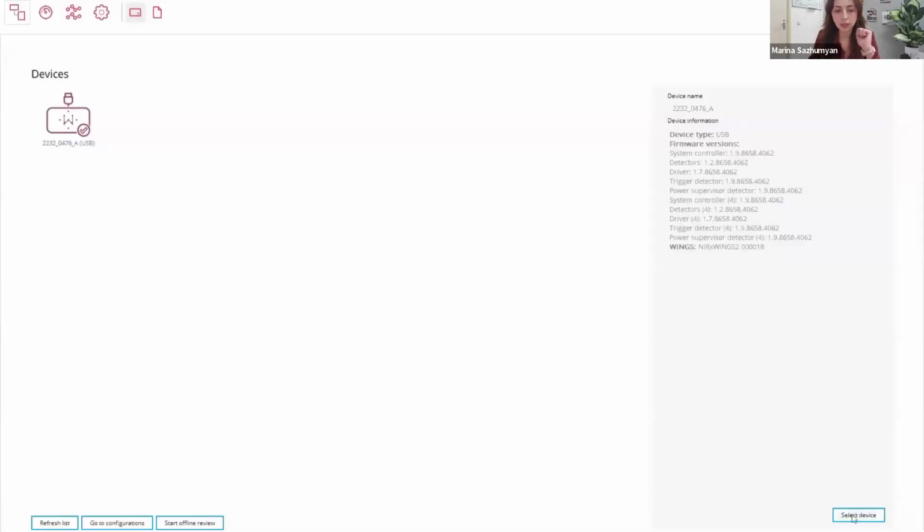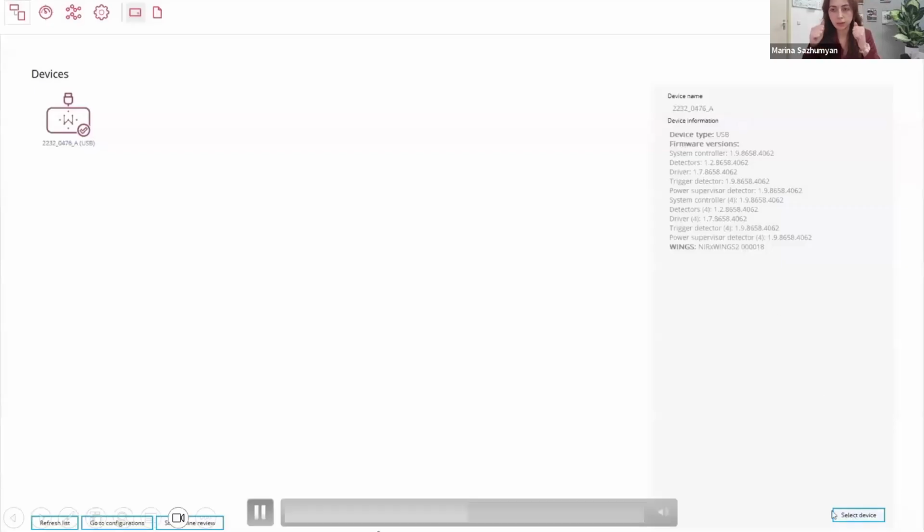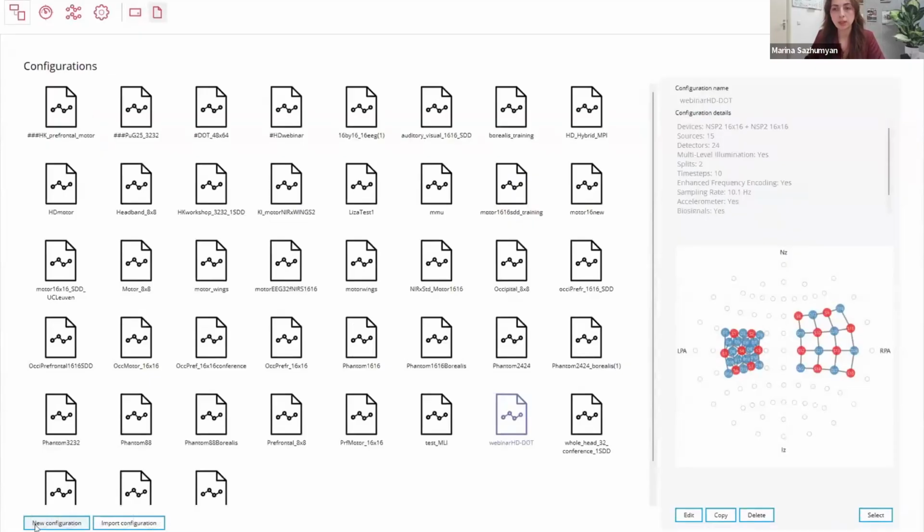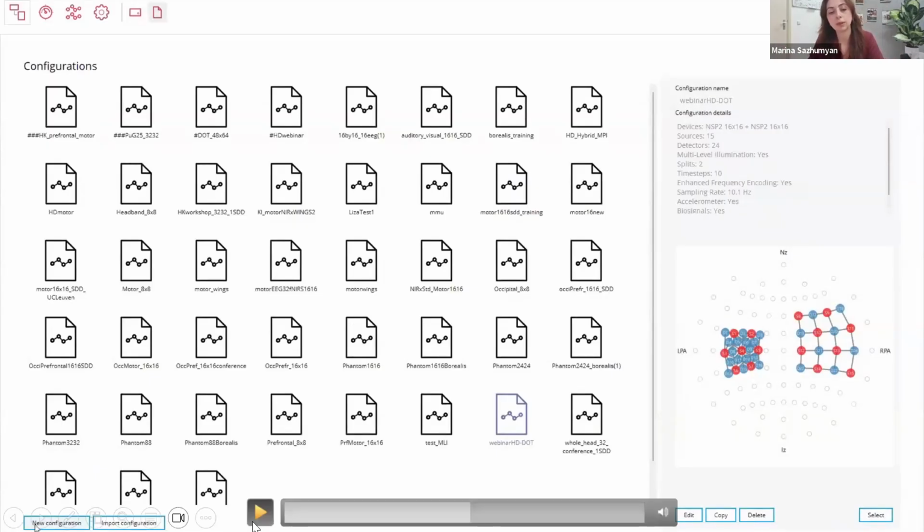What you see the participant doing in the beginning is this shimmying of the head, holding the cap and shaking the head. We find this to be very useful for improving the optical contact. It really saves time instead of individually removing the hair away from the opto tips. Especially with the double tip optos, the double tip actually serves as a sort of comb to comb through the hair and move it away from the opto tip. So it really significantly reduces the preparation time.